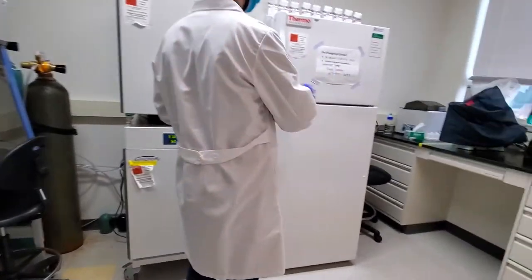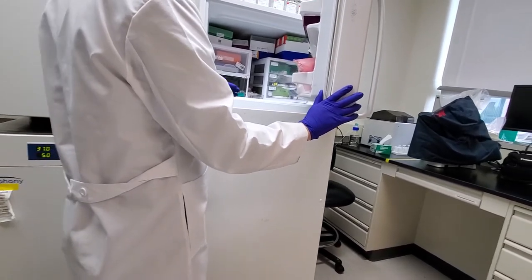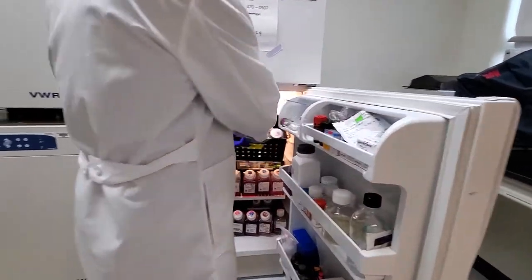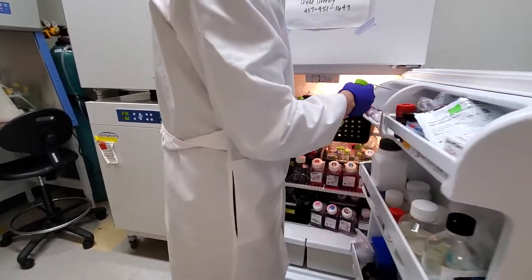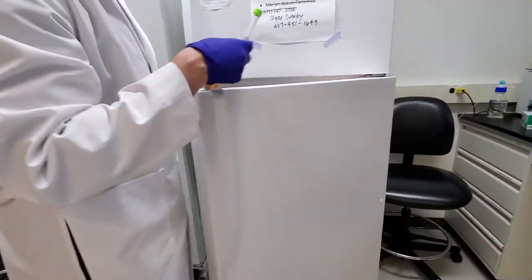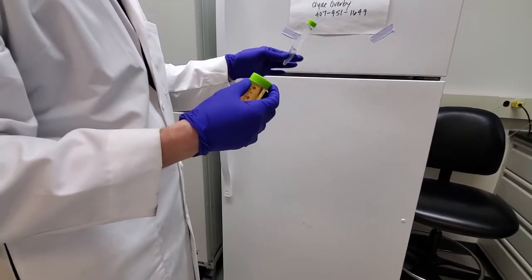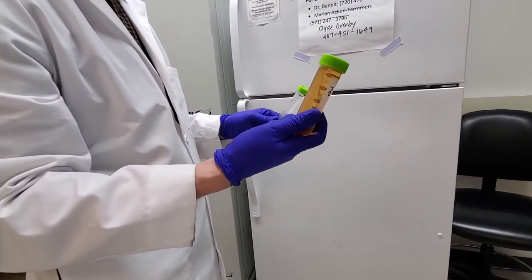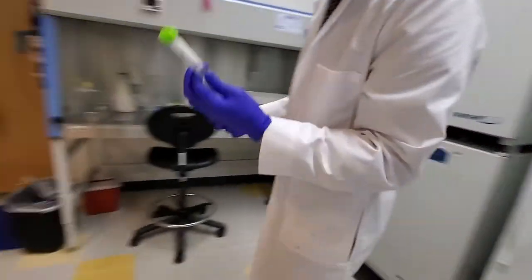I had Arvind thaw some FBS stocks and some penicillin streptomycin, fungicide stocks we keep up here. I had him thaw some of those last night in the 4C just to get a head start on things. This is abbreviated PSF for penicillin streptomycin, fungicide, amphotericin B, and this is a 50 ml aliquot of FBS, fetal bovine serum. We're going to do a 10% concentration of FBS in this media.